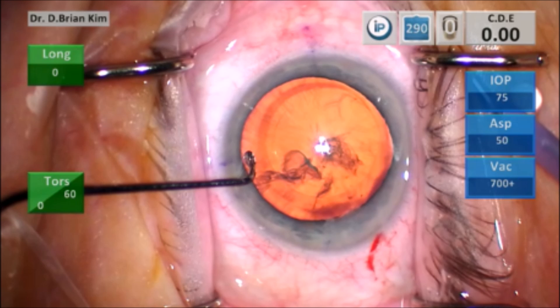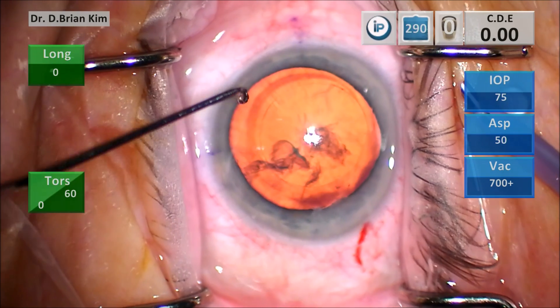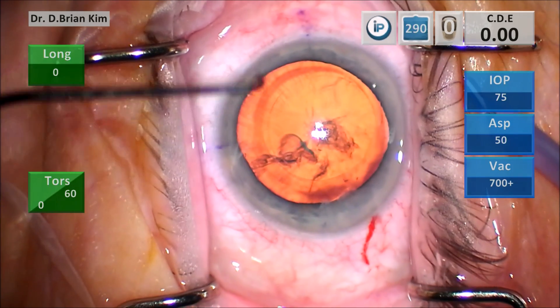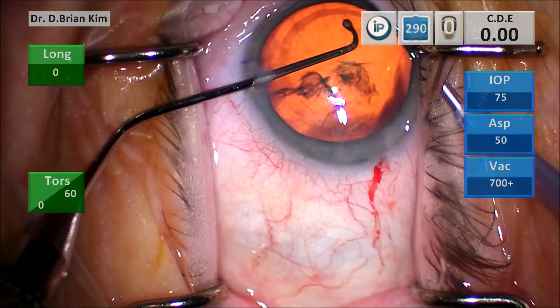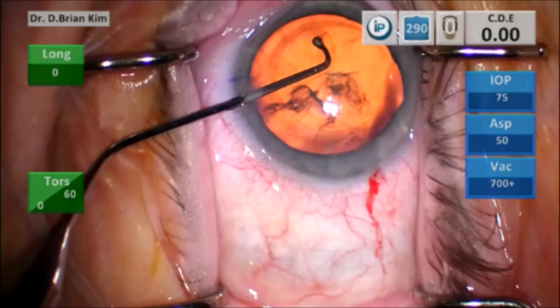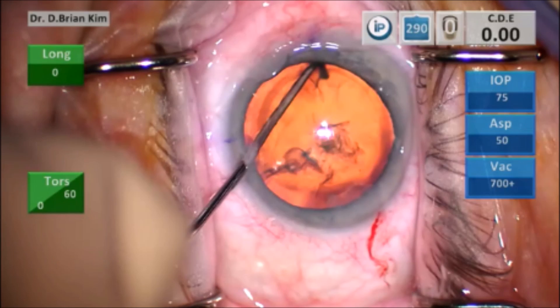This is the proper position of the chopper. When I go into the eye, I want to stay in the pronated position with my wrist and then supinate my hand so that the chopper tip is facing me when I initiate the chop. I go into the eye pronated, sliding the chopper in the pronated position down into the epinuclear material underneath the anterior capsule, then rotating my hand so that it's supinated.